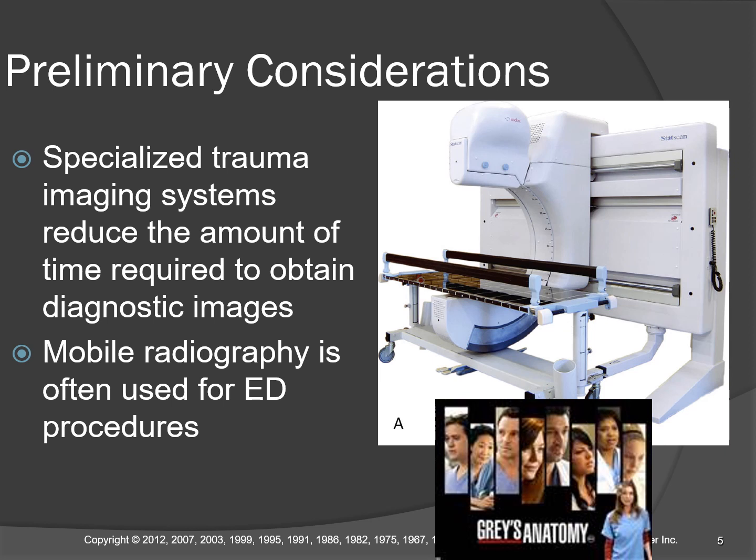If you work in a hospital based on NBC sitcoms, then you'll have the latest and greatest in trauma imaging systems. This is called a stat scan machine.